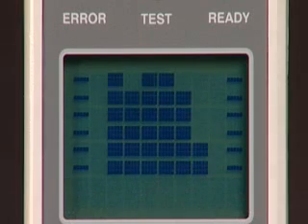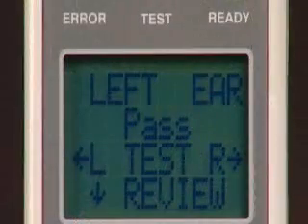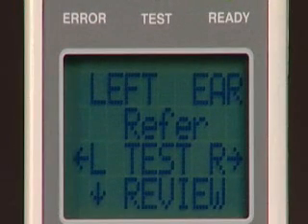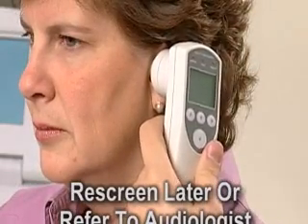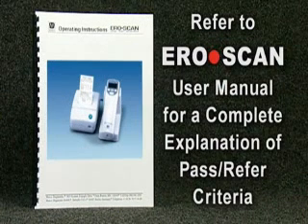Once the testing sequence is completed, the results will appear on the AeroScan's display. A pass result indicates the patient passed the screening, reflecting normal outer hair cell function in the inner ear, which is highly correlated with normal hearing. A refer indicates the patient did not pass the screening. Because probe placement is key to successful testing, you should reposition the probe and rerun the test. If a refer result continues, the patient should be rescreened later or referred for further testing — this result does not indicate a hearing loss until follow-up testing by an audiologist is completed. Refer to the AeroScan user manual for a complete explanation of the pass/refer criteria.